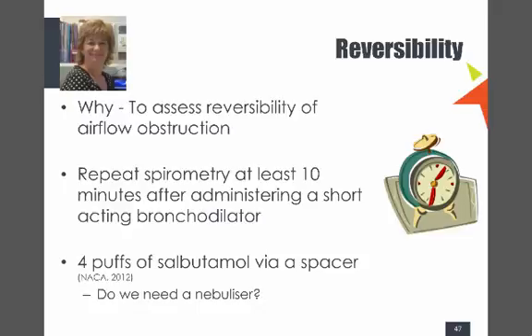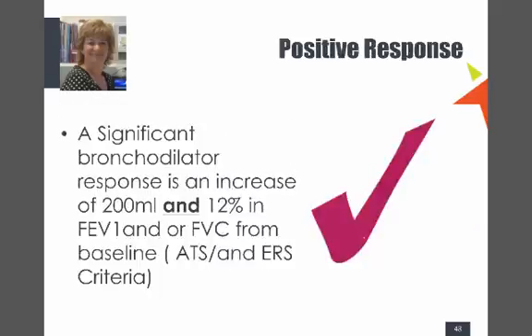So I've given my bronchodilator, and I repeat it after 10 minutes. That's where the National Asthma Council for 2012, an attached document, actually says 4 puffs of salbutamol. I don't think I've ever seen anyone give that little, but I did an assignment on spacers versus nebulizers, and we're still using nebulizers left, right and centre without any real evidence. So it's quite an interesting concept. So yep, we do it.